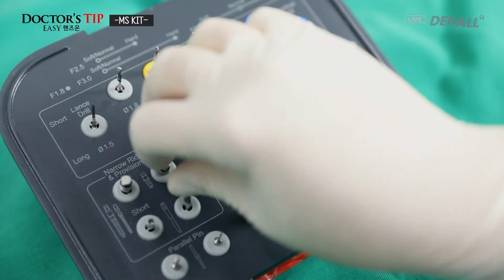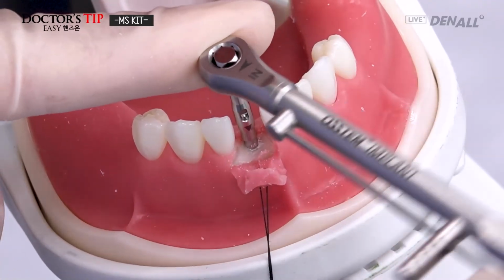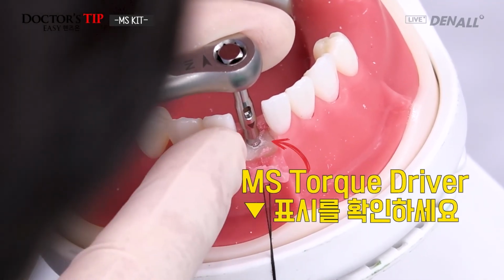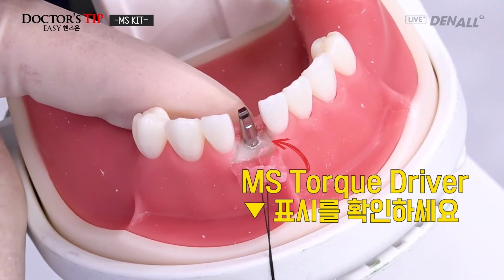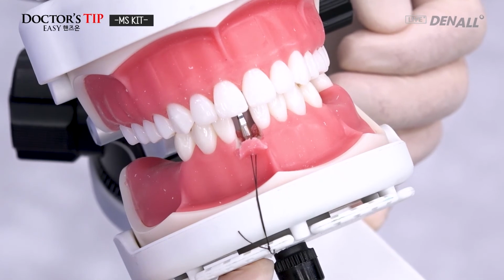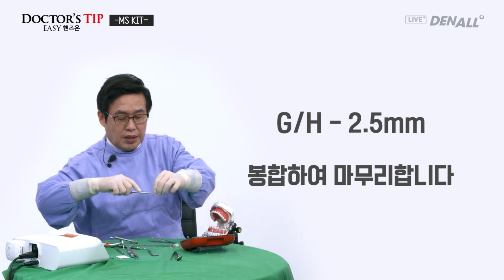And then I use this torque wrench, and you do the placement. Final positioning. Again, this triangle exists on the torque driver, so the position of the final prosthesis can be checked. And let's see whether it's aligned. Gingiva height is 2.5 millimeters, and I'll do suturing. Very simple suturing.